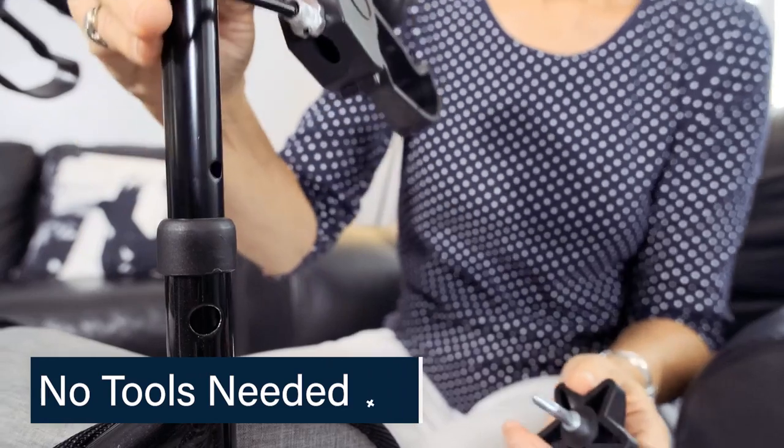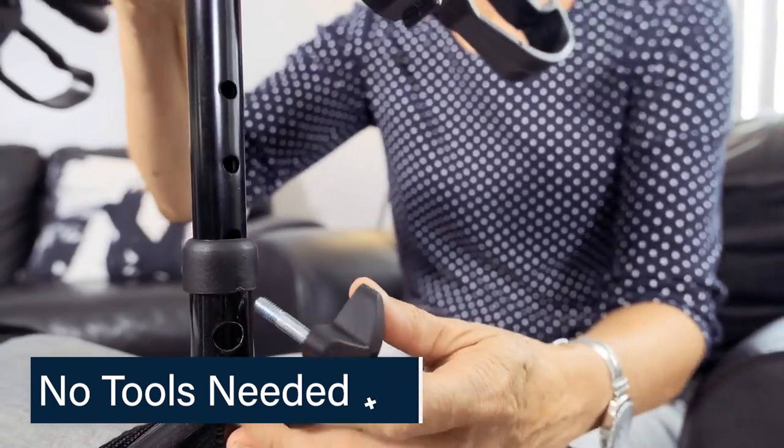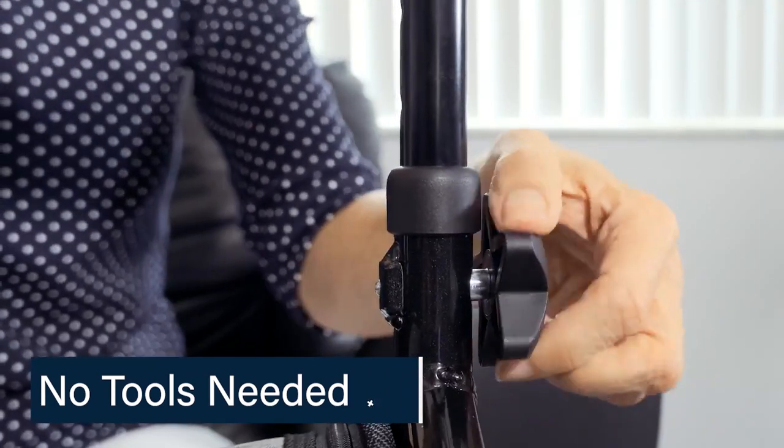Not only is the Rollator assembled without tools, you can adjust the handle height with push pins for personal comfort, tool free.